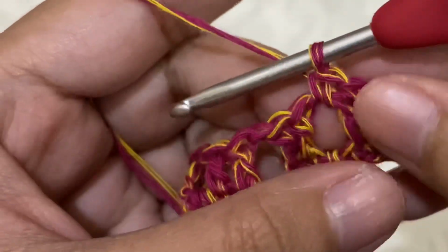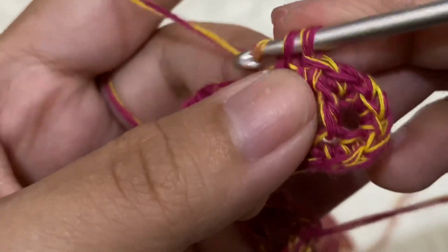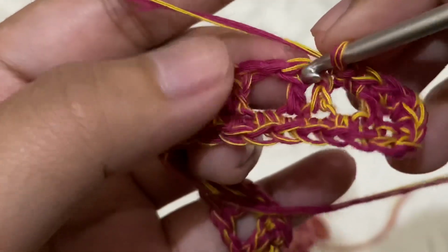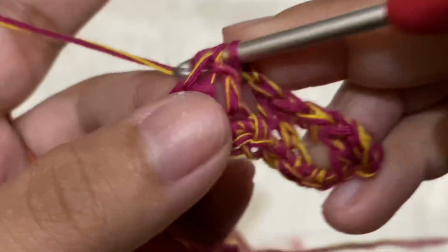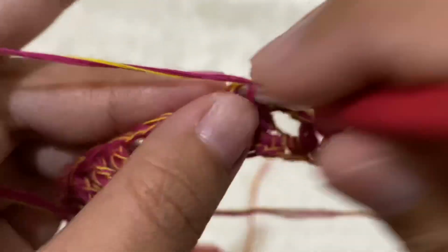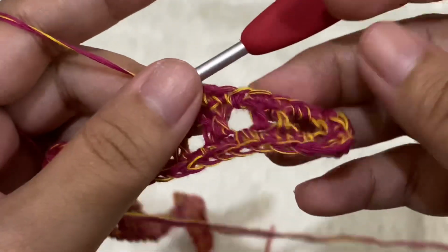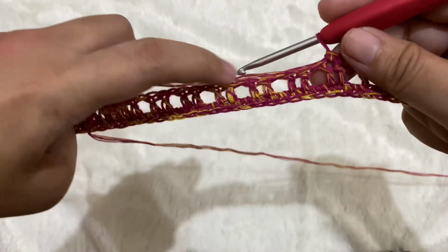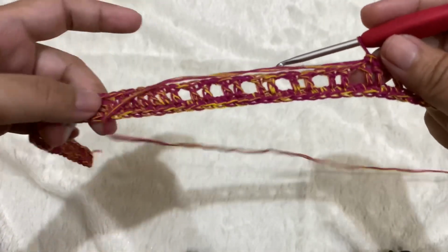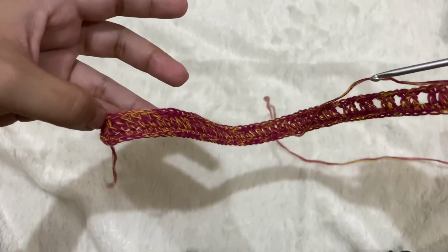So same thing, just single crochet again on each stitch, on top of those double crochets and around the chain space. Okay, so just keep doing so until you reach the end. So all the way right there. Okay, so all of those stitches until you reach the end, that one.